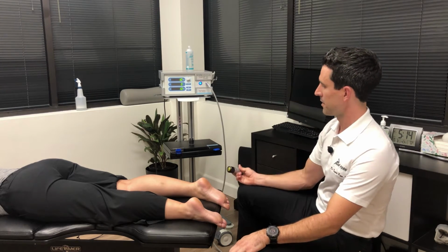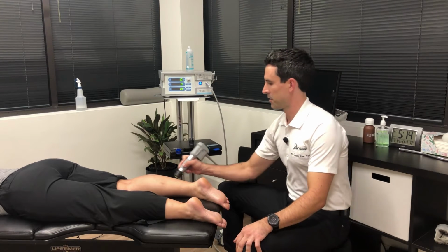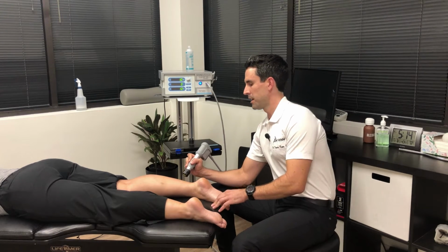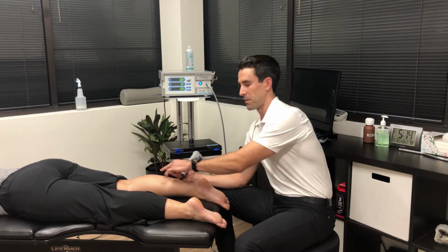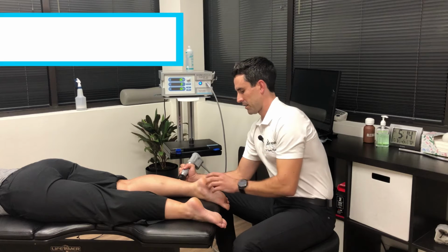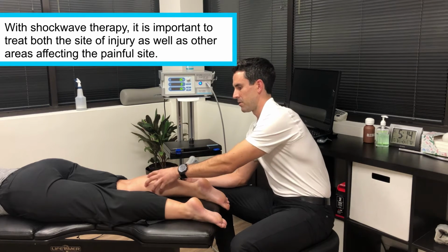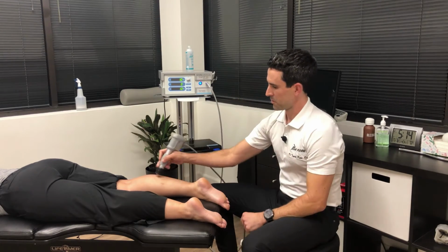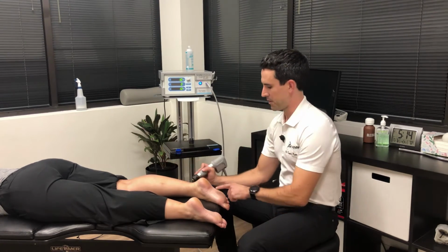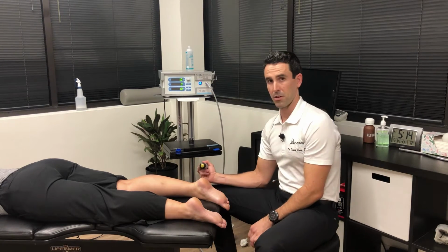And then the final thing that we're going to use the shockwave for is we're going to try to treat the whole kinetic chain here. So we're going to use the shock waves and the acoustic waves to break down myofascial adhesions within the calf musculature, because a lot of times plantar fasciitis symptoms are dependent on how tight and how much mobility there is in the calf musculature themselves. So we're going to use the treatment up in this area, and then we're going to work the entire plantar fascia into the forefoot and into the arch of the foot here.